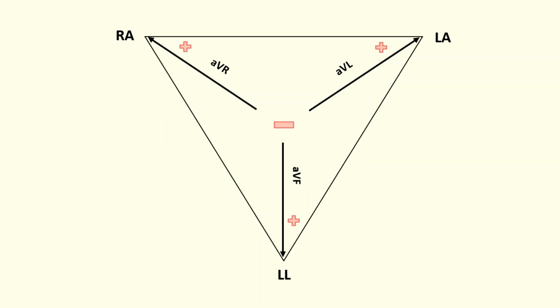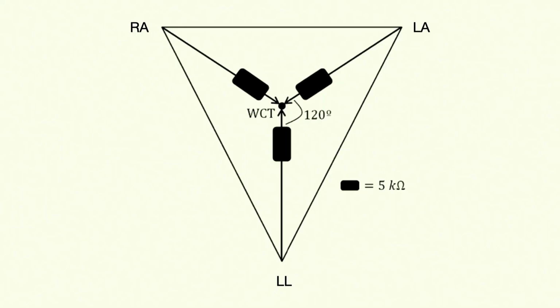The leads I just showed you are all bipolar leads, but how do we get AVR, AVL, AVF? What's the negative pole for those electrodes? What is it? Okay, it's theoretical, but do we just tell the ECG to think about what a negative electrode might be? Yes, you're getting closer. So the negative terminal of these electrodes is actually the right arm, the left arm, and the left leg all combined and essentially averaged. And that's a mathematical point that puts you roughly in the center of the chest.